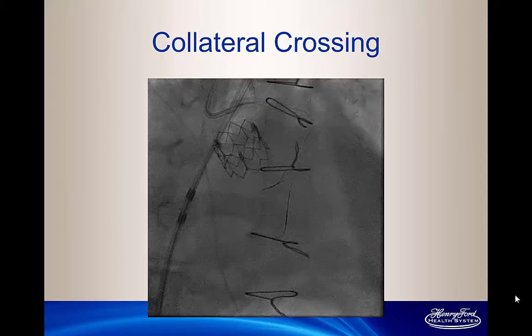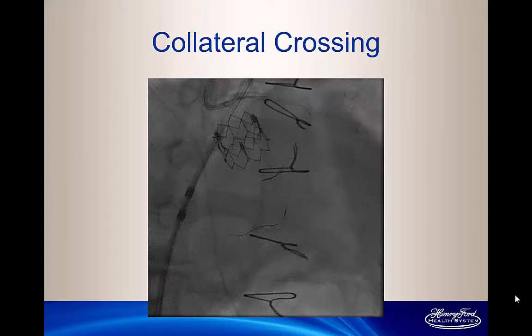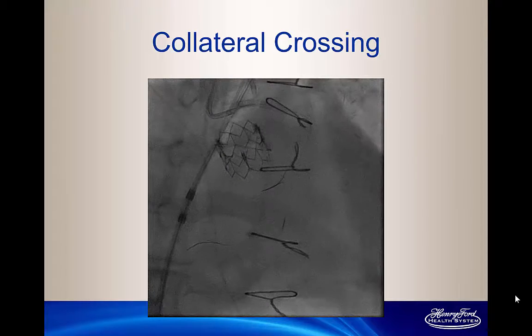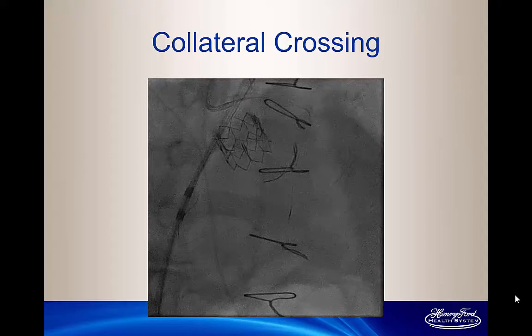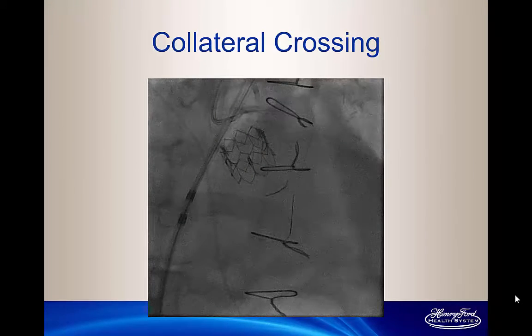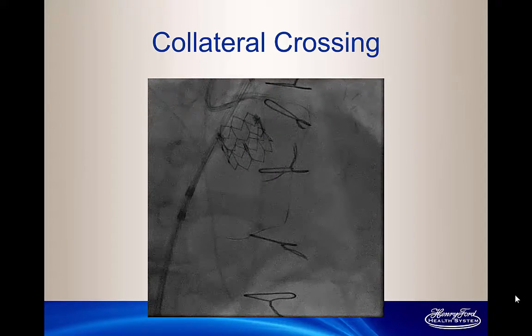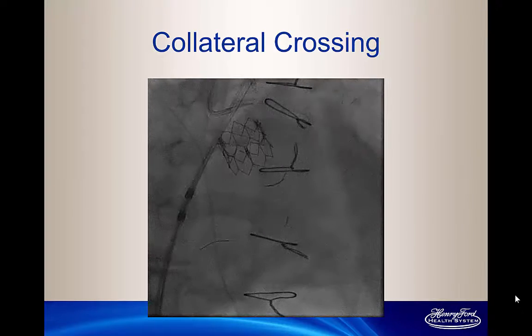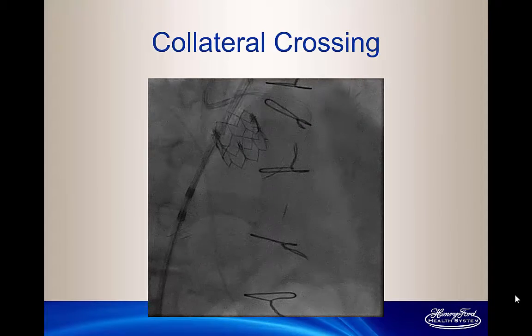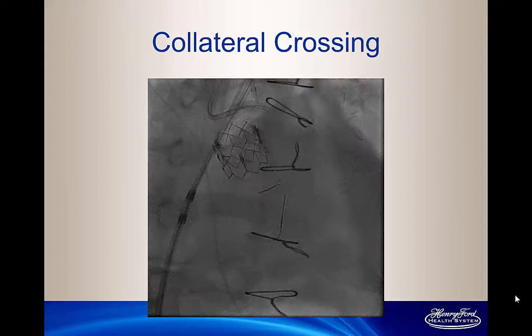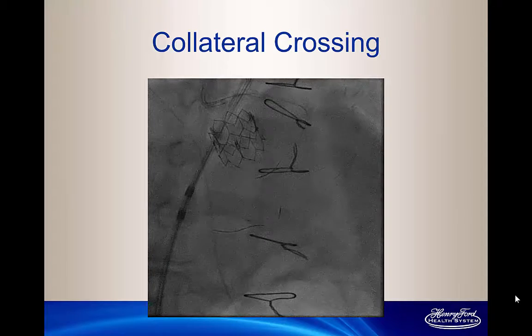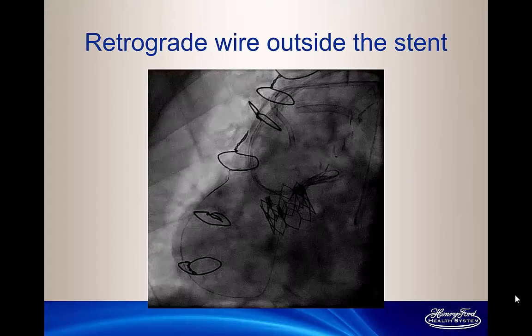This patient has an ambiguous proximal cap, obviously. A very long occlusion — you can only see a little bit of the RCA — poor distal targets, and very good collaterals. So this patient is a good candidate for a primary retrograde technique, especially because he has a flush ostial occlusion. We used a Sion wire in addition to Turnpike LP in the first septal, and this is real-time crossing into the circumflex.